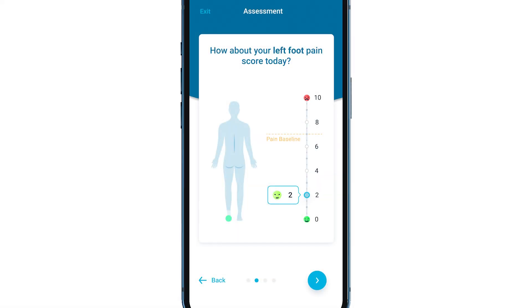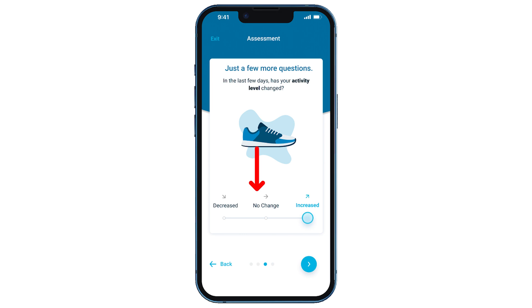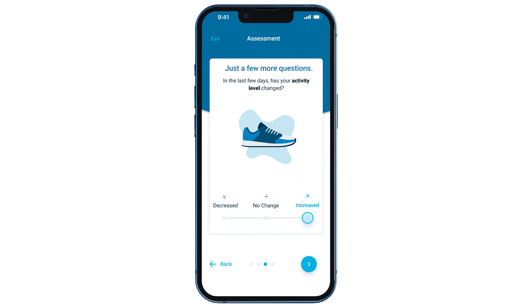Remember, we're only tracking the pain your physician placed Nevro HFX to help with. Once you have documented your pain score, tap the arrow to progress to the next screen where you will note if you have had any change in your activity level.